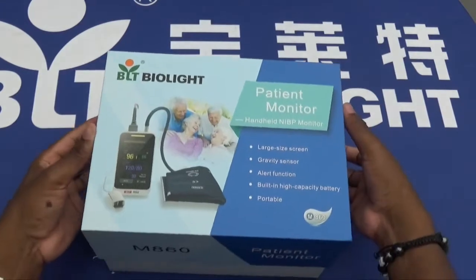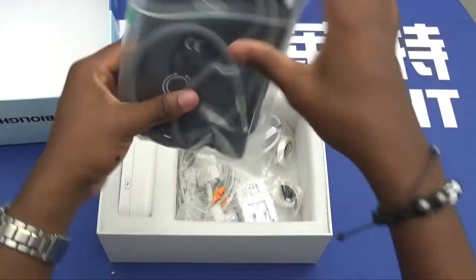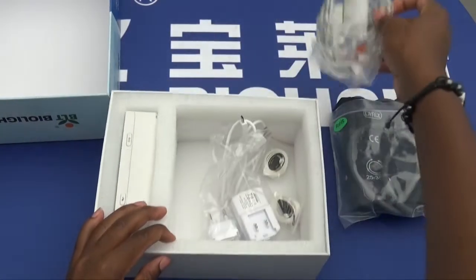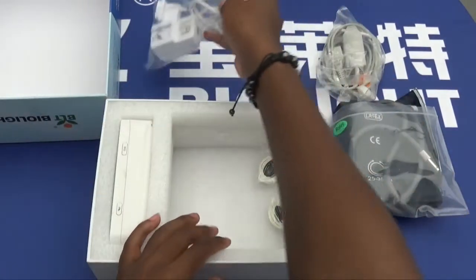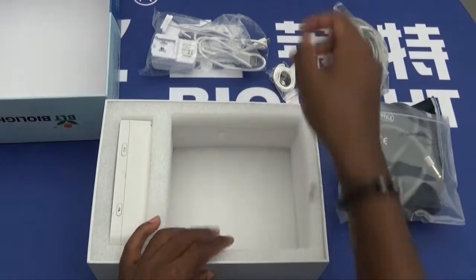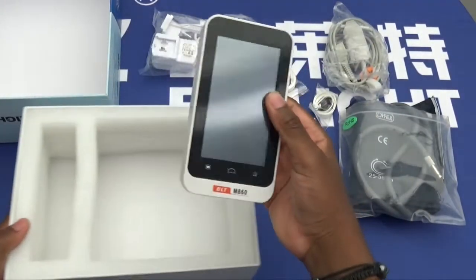Opening the box up itself, we have the NIBP blood pressure cuff, we have the SpO2 cable, we have the charger cable and wall plug outlet, and then we also have two lanyards included. The device itself is located on the left-hand side.